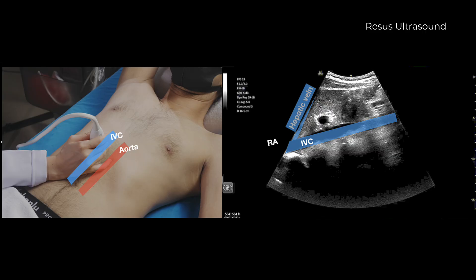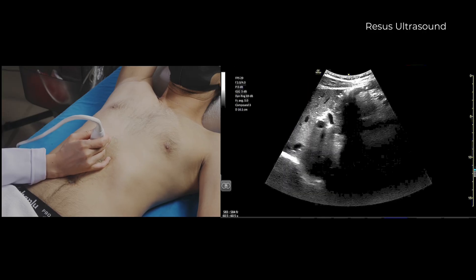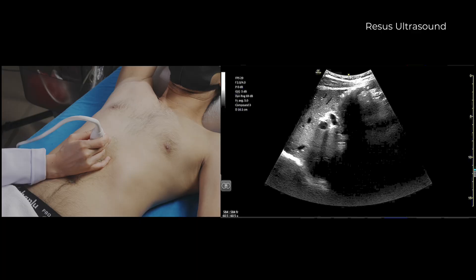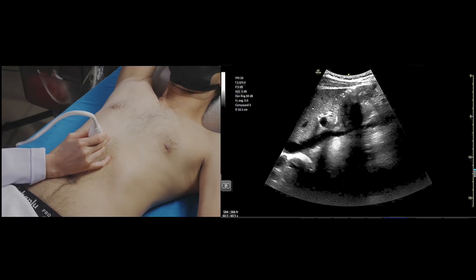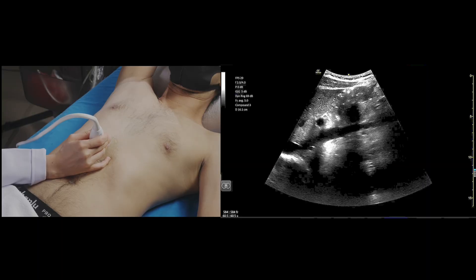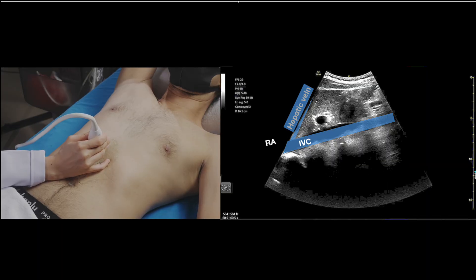We then turn to the long axis by rotating the probe 90 degrees clockwise, from 3 to 12 o'clock. This will visualize the long axis of the IVC joining the right atrium and the hepatic vein draining into the IVC. When measuring the IVC diameter, we choose a location at 2 cm below the right atrium-IVC junction, or 1 cm below the hepatic-IVC junction.